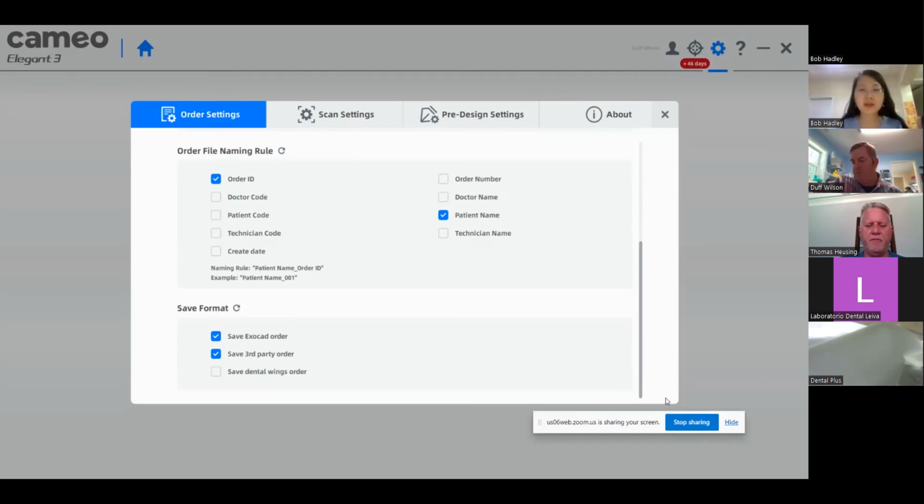The first one is from a client called Tan. He asks, how many uses before replacing the lens attachment? Fiona, I'm kind of thinking the lens attachment would be the same as the tips, right? The tips. I think so. I think he's asking about the tips. Yeah, so you get 100 uses out of the tips, because every time you use it, you need to autoclave it and clean it. So you get 100 times.